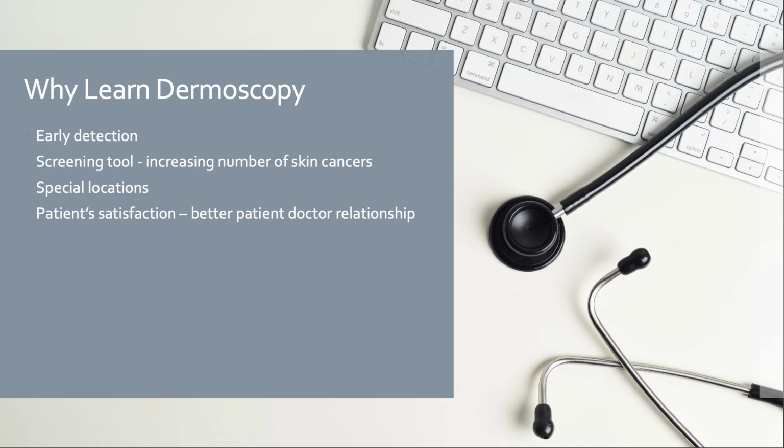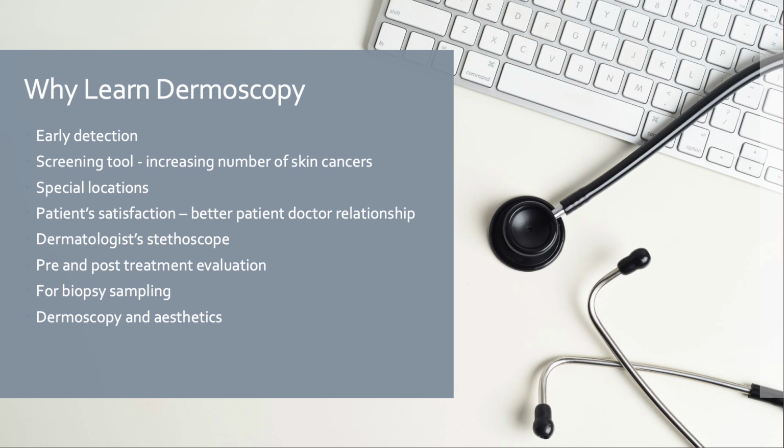It gives the patient immense satisfaction and helps in building a good patient-doctor relationship. It acts as a dermatologist's stethoscope and helps in pre- and post-treatment evaluation, not only of the skin cancers, but also for the inflammatory disorders. It's also very important in identifying the area truly representative of disease for biopsy sampling. And last but not least, it also has a role in aesthetics.